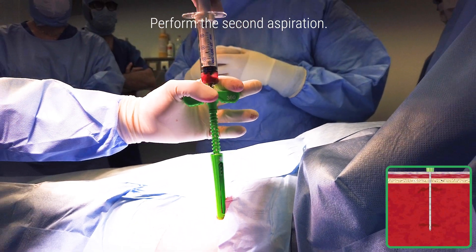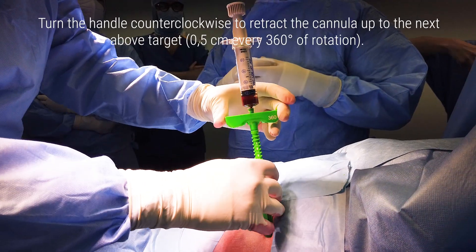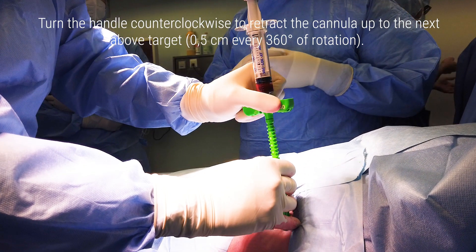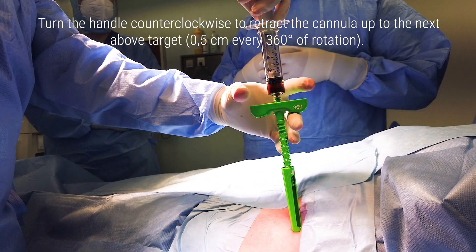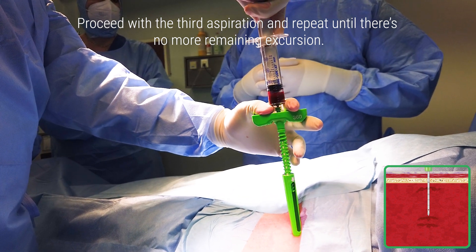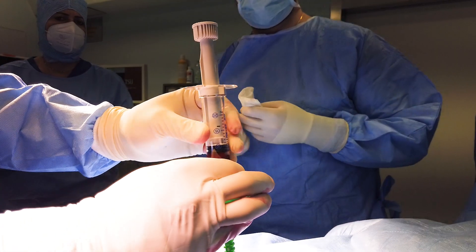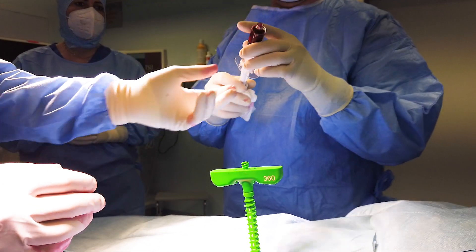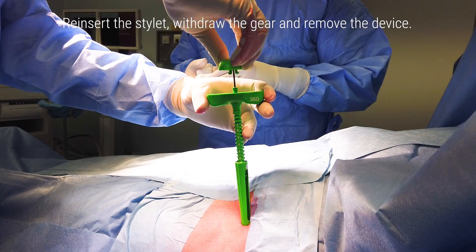Perform the second aspiration. Turn the handle counterclockwise to retract the cannula up to the next above target, 0.5 cm every 360 degrees. Proceed with the third aspiration and repeat until there is no more remaining excursion. Reinsert the stylet, withdraw the gear, and remove the device.